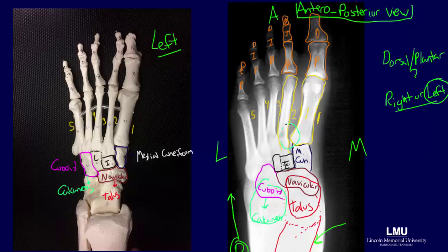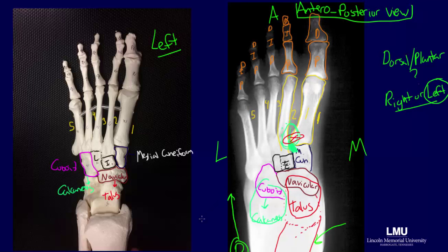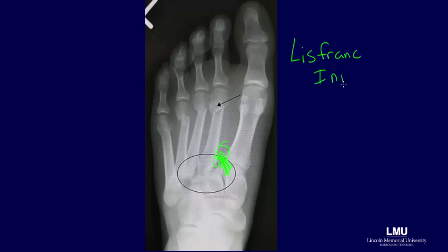After evaluating the cortex of each bone, we turn our attention to spacing, starting at the most proximal portion of the first and second metatarsal. An increase in space here could indicate a Lisfranc injury, when the Lisfranc ligaments connecting the medial cuneiform to the proximal portion of the second metatarsal become damaged, as there is no ligament connecting the most proximal portions of the first and second metatarsals. In this radiograph, we can see an increased space between the most proximal part of the first and second metatarsals, indicating compromise to the Lisfranc ligaments — classified as a Lisfranc injury.